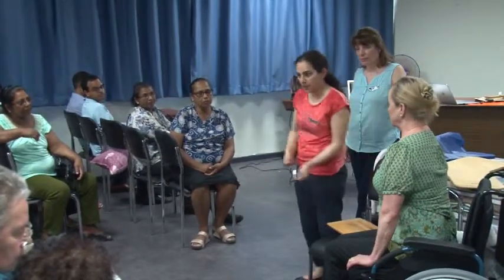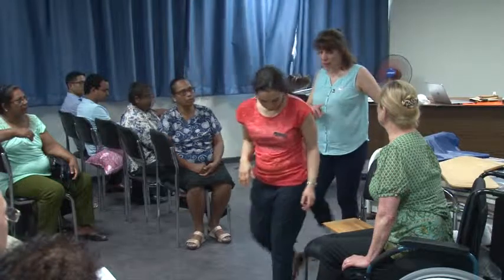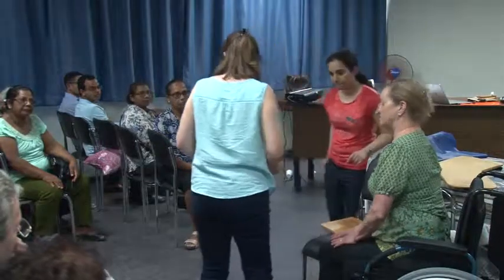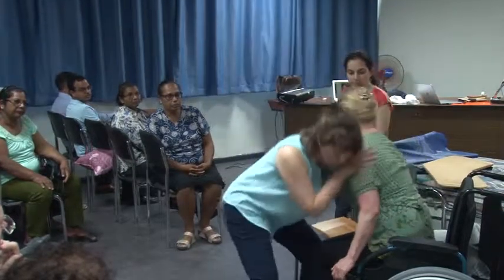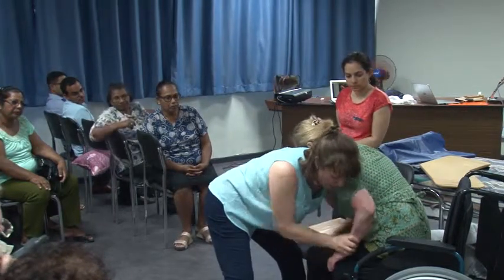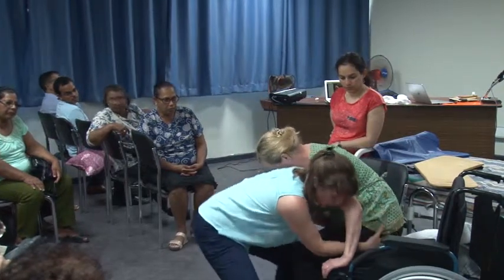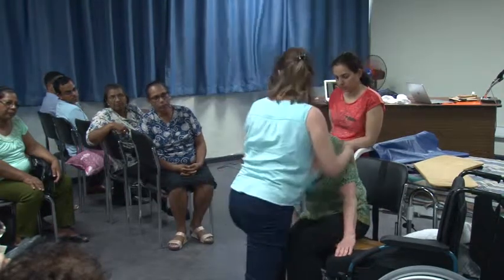Wherever possible, ask the person to do small lifts and avoid this because, as I said, if they're not properly dressed, there is a chance that it can cause friction. When somebody's really, really weak and early at the beginning, you can still use the board, but give them a bit more assistance by not using the lift technique if they really can't do it, but actually getting them to come all the way forward. And they've got to trust you as a supportive carer, but you can actually give them yourself here to lean on. They can still do a bit with their lift, so they're still going into their lift. You get them to lean forward, de-weight, and they can do a tiny bit. You just, by hinging them forward onto their feet, you can guide them over.